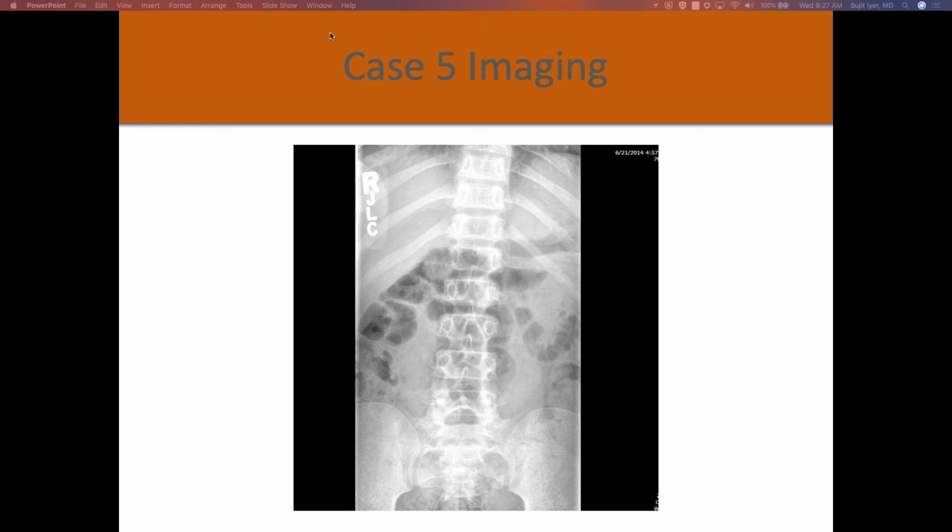Is that the only image? I'm afraid to go to the next one. What if you look at that? Oh, this one. No, there's one more. I mean, that's my point, right? Sometimes you'll get, I think you just asked for a lateral. If we call Dr. Leake and say, hey, look, I got that, I mean, he's good, but we're kind of stacking the odds against him, right? So you reap what you sow.